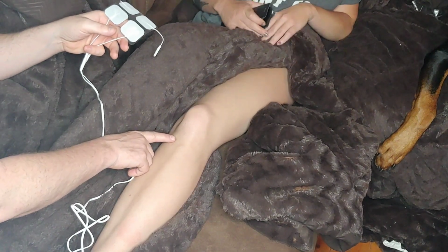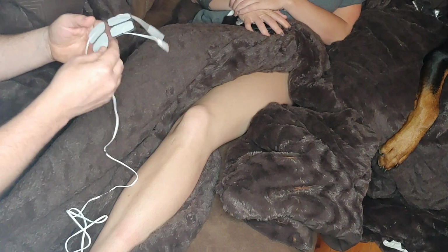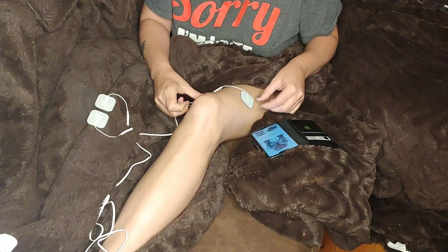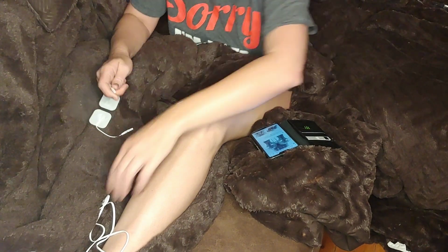She wants to get this muscle going. She had knee surgery. You can see the scar there where she had an ACL replaced and she had her meniscus worked on. I did touch those in the right place. Hey, you want to place one, you said? Yeah. And there needs to be one right here. Okay, go ahead and put them on there.